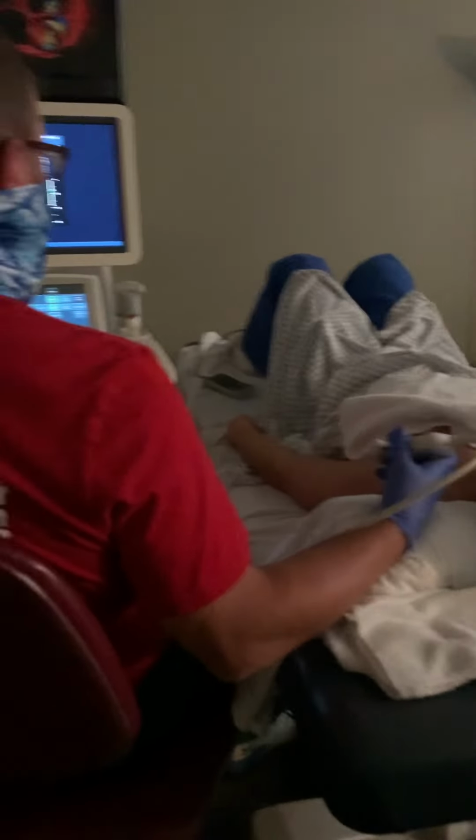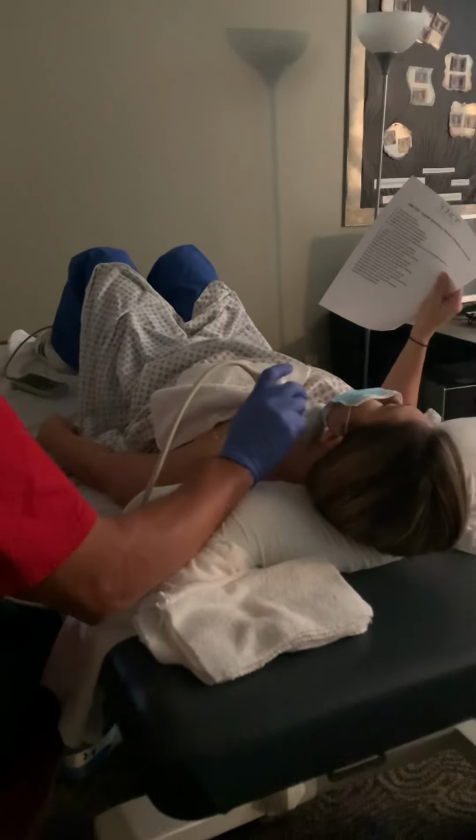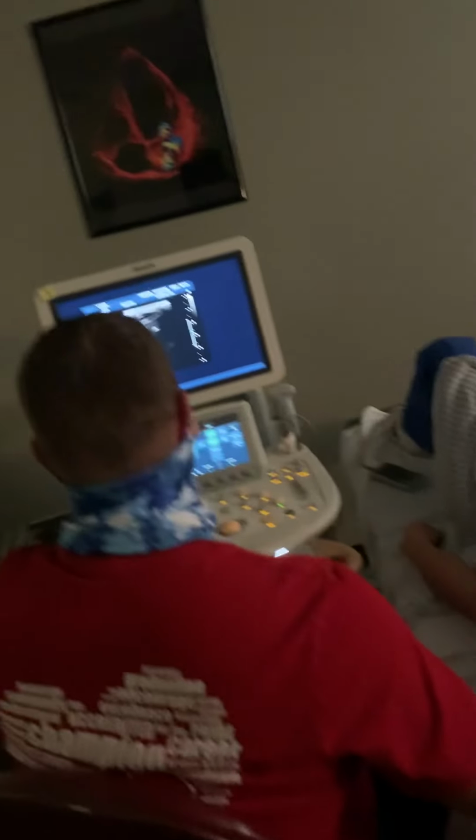An ankle again, yes? We're not going to do that on the upper extremities. We're going to take everything we need at each level as we go. So, first image is what?